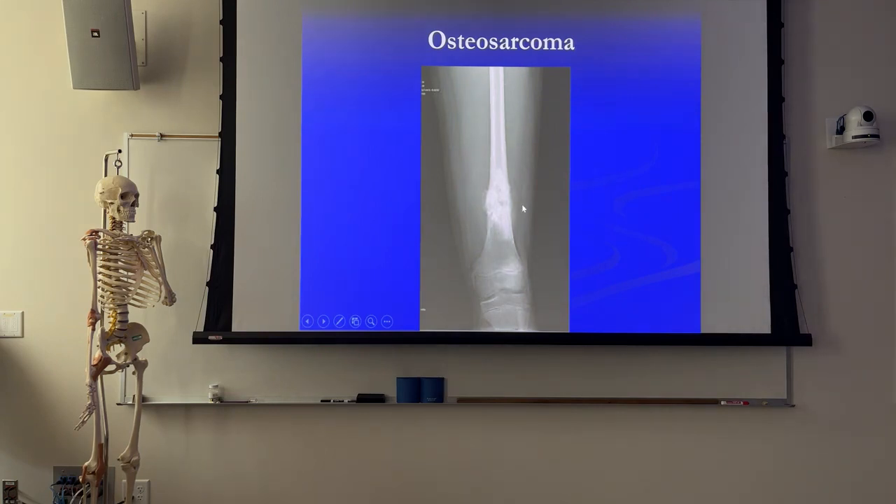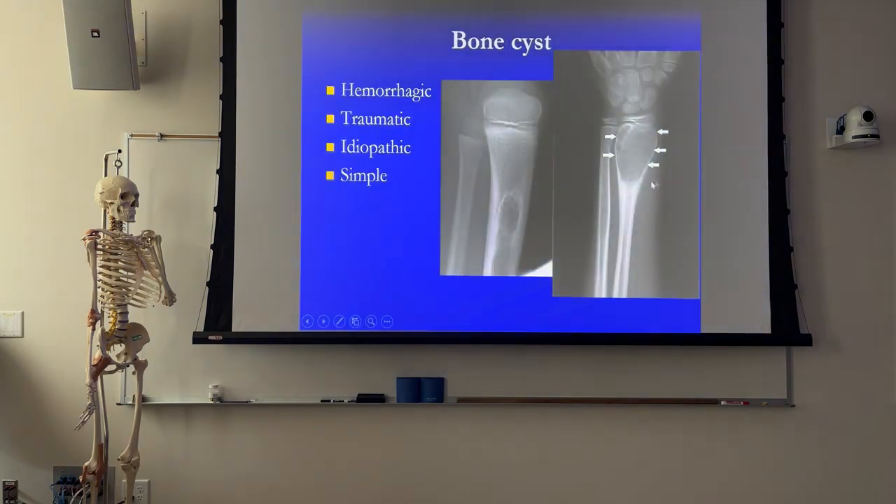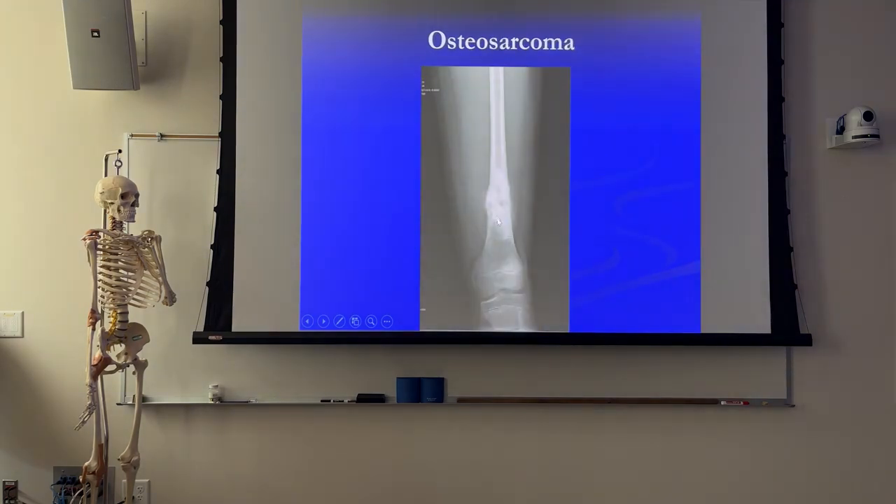With osteosarcoma, now we've got actual bone cancer. You see where the cortex is - it just has that eaten away appearance, almost like rotten wood. That's bone cancer as opposed to bone cysts. Bone cancer shows increased radiographic density with a thinner, eaten-away cortex.